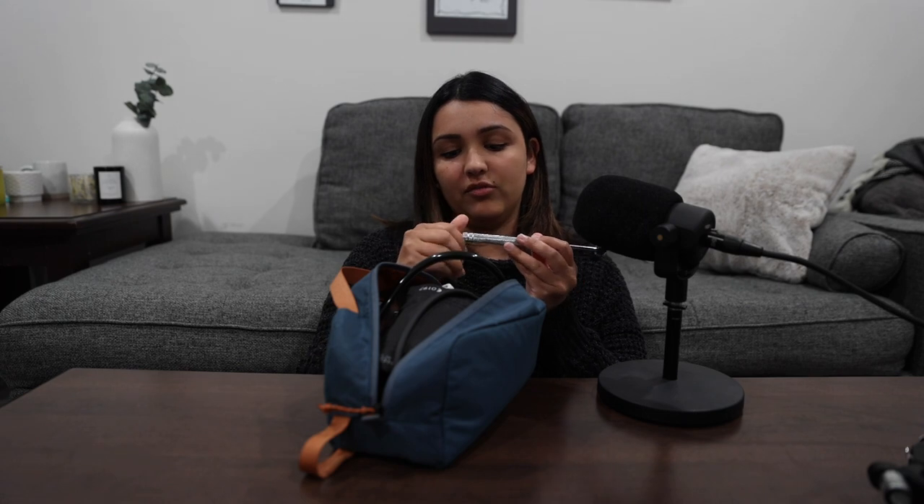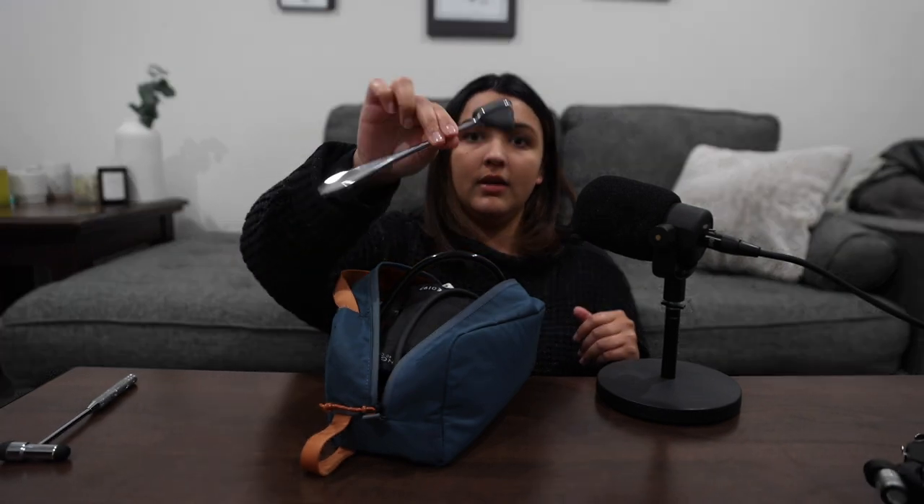To start off, I did get this reflex hammer from school. It's the kind that has a soft touch at the bottom and a sharp touch as well, but I don't really use it for those reasons. It's a pretty good hammer. However, I chose to get myself another one — I like this kind a little bit better just because I feel like it gives me more surface area for reflex testing. But it's pretty nice to have both.